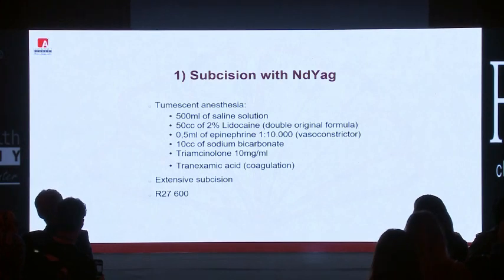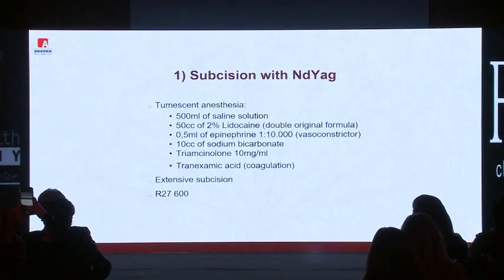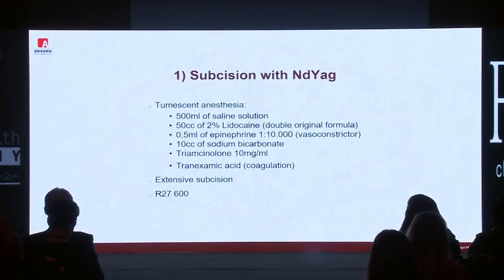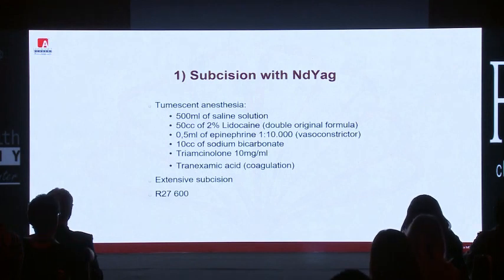The only difference from my first presentation is the anesthetic solution preparation, because as you can see, the quantity of lidocaine is higher, double the other, and in this case I use triamcinolone to avoid excessive post-treatment inflammation.